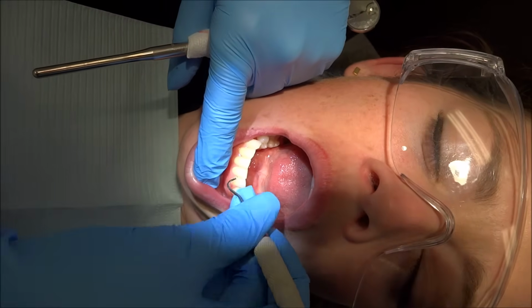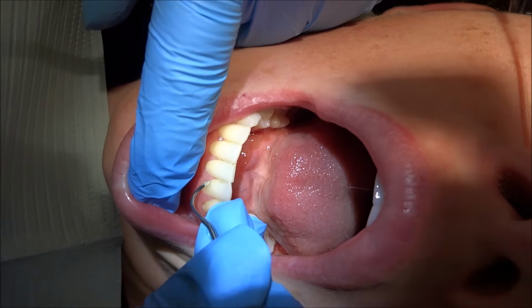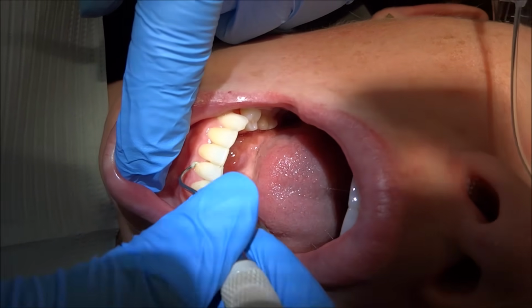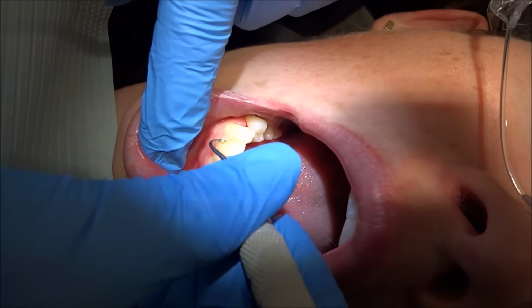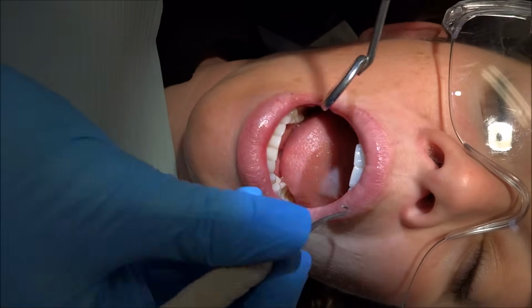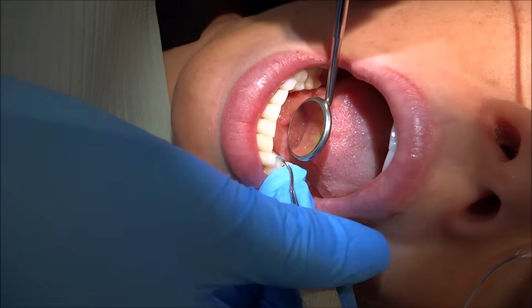Just got a little cement on there from her braces, that's why that turned gray right there. Sometimes you can get that off, but sometimes you have to have the dentist smooth it. It's best to start canine to canine so that you don't miss or skip any teeth. If you're starting right in the middle, like on 24 and 25, then you might forget to actually do your canines.